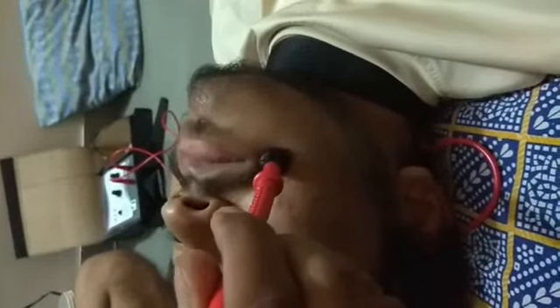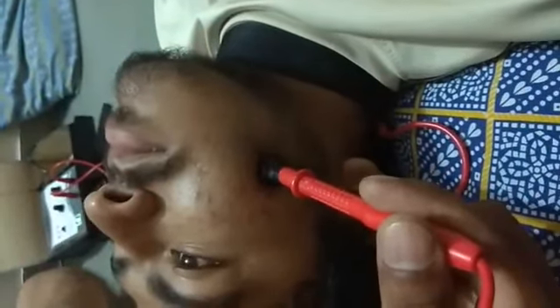This is the motor point for the nasalis muscle. This is the motor point for the orbicularis oris muscle. This is the motor point for the mentalis muscle. This is the motor point for the buccinator muscle.